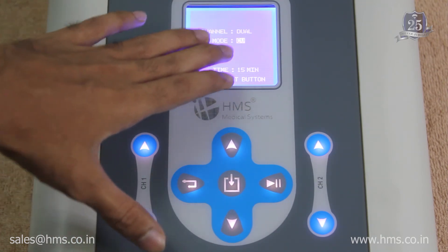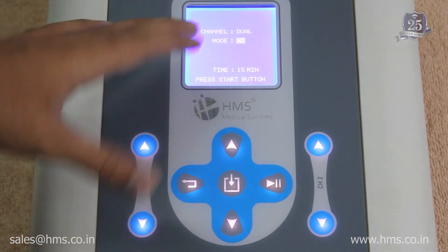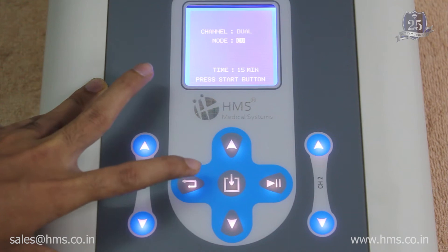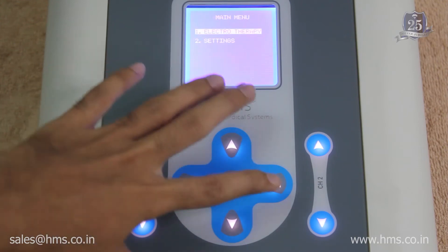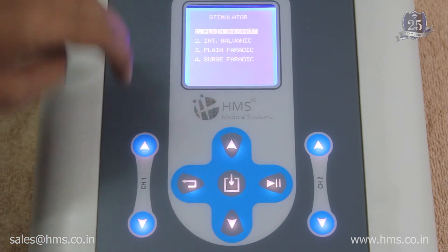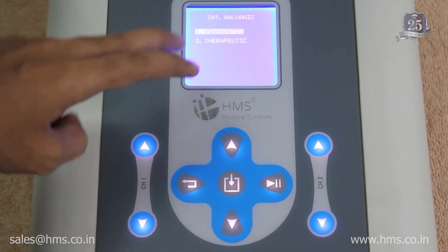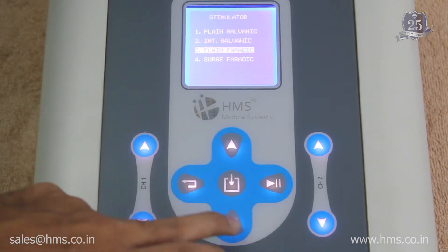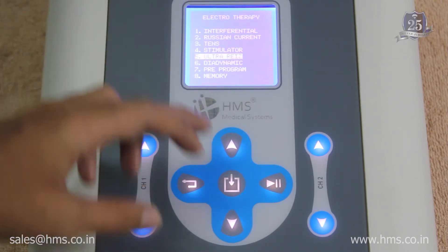The CC and CV modes are available across all modalities, including IFT and Russian current. After TENS, there is the stimulator, which has four different modes: plain galvanic, interrupted galvanic (with diagnostic and therapeutic sub-modes), plain faradic, and surged faradic.